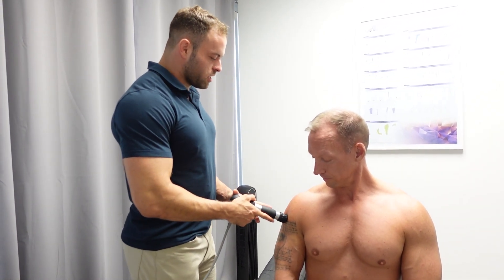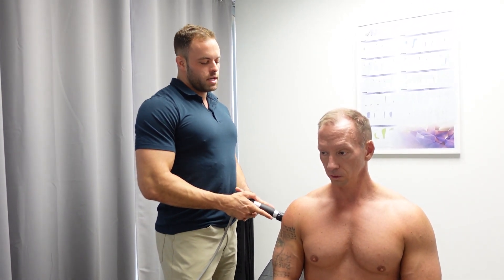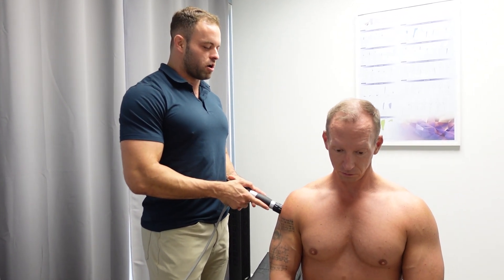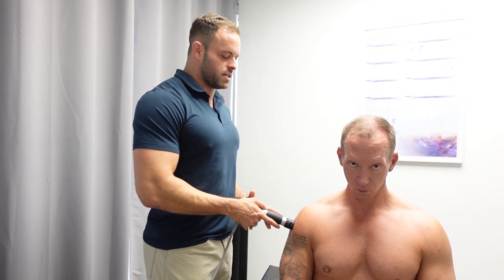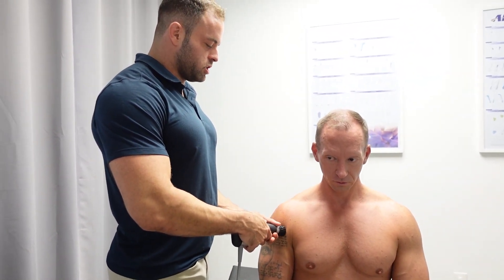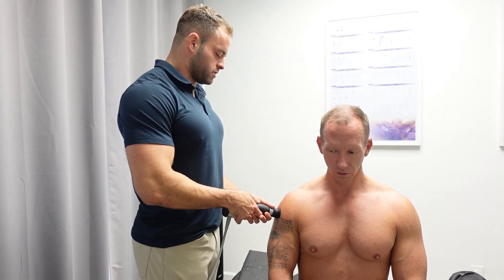So what I'm doing here is scanning through the shoulder with this probe. This is sending acoustic waves into the muscles, so any area where Dr. Eric feels a little bit of an increase in sensitivity — that's going to be an area where there's actually damage or some scar tissue that we're treating with the Shockwave device itself.